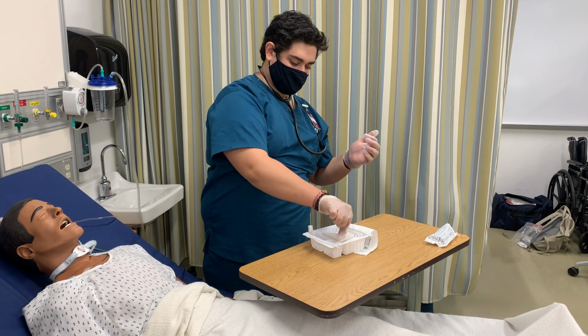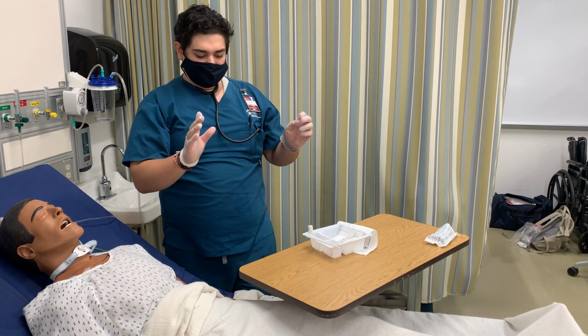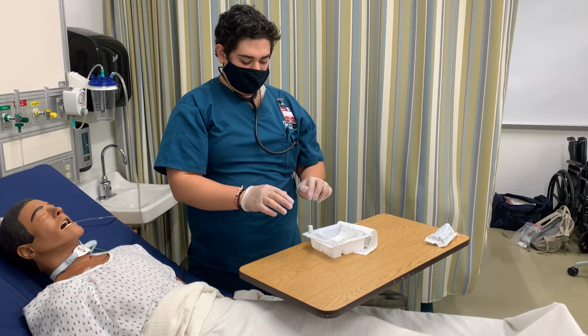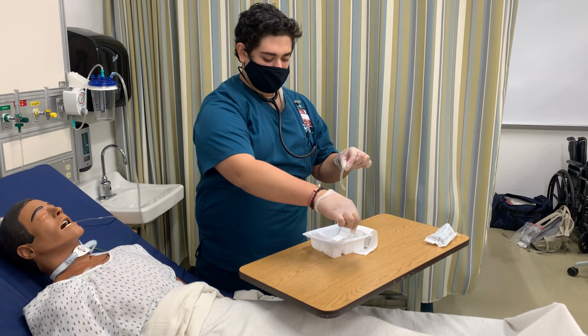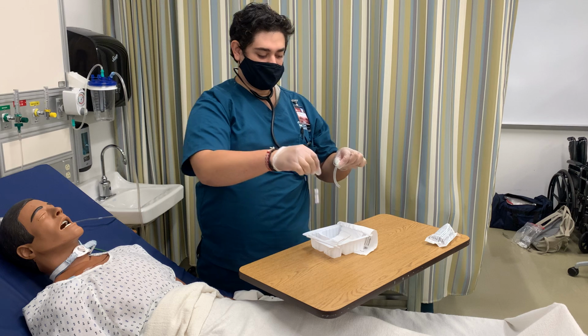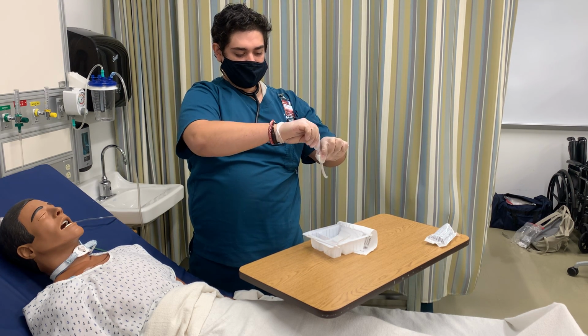Okay, I will be disposing of this. So I do have my sterile location here. Making sure that I'm only grabbing the white part of the inner cannula, doing a full thorough cleaning.